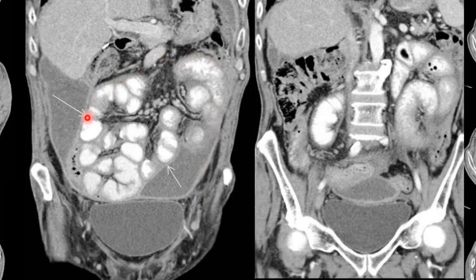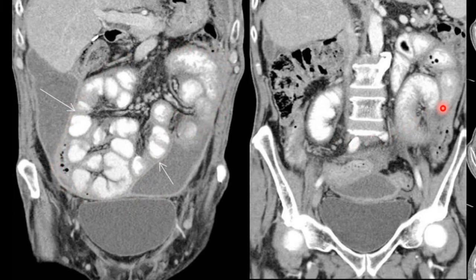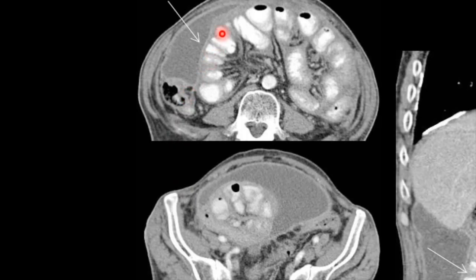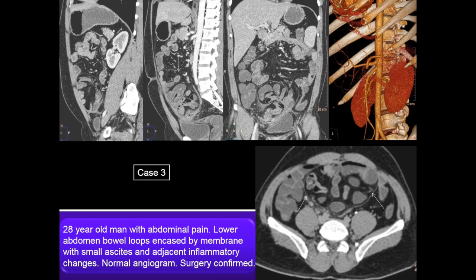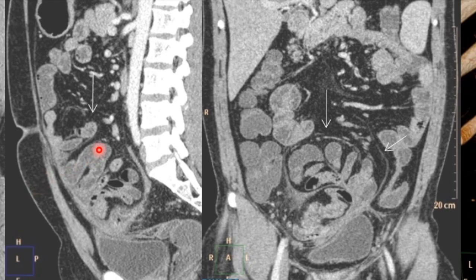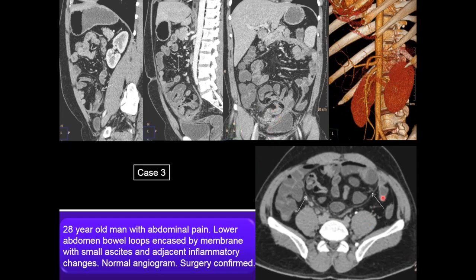Multiple small bowel loops encased in a membrane-like structure are visible. The third case is a 28 year old man with abdominal pain, where lower abdominal bowel loops are clumped with a partial membrane-like structure around them. Minimal ascites and inflammatory reaction were also seen. No abnormality was seen on the abdominal angiogram and surgery confirmed the diagnosis of cocoon.